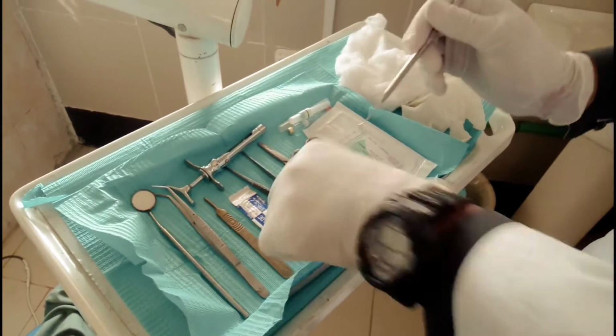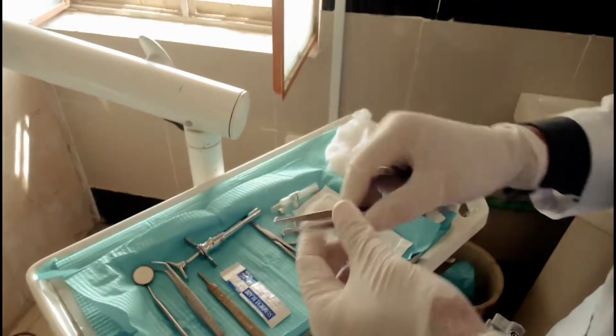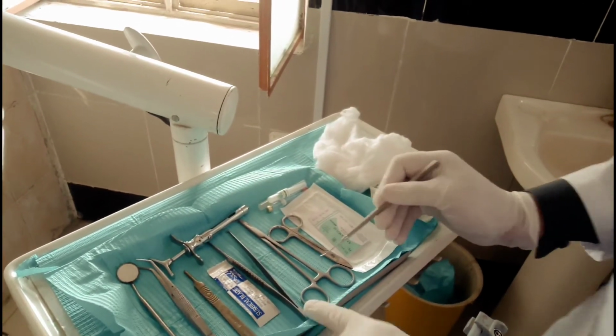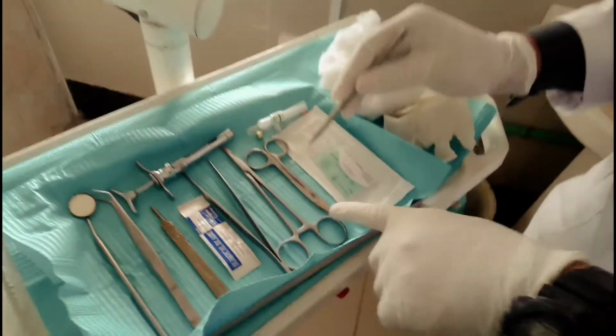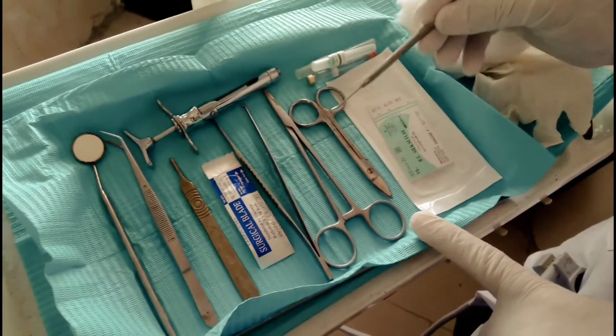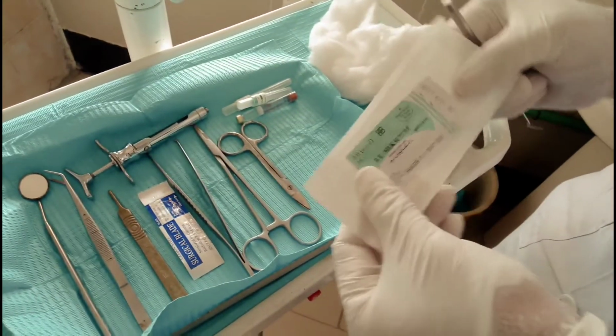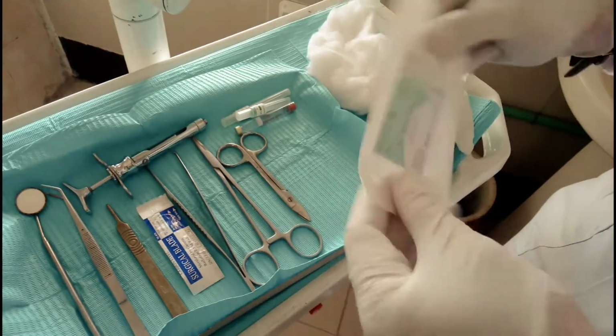And this is the tissue forceps for the retraction of the oral tissues. And this is the needle holder. And this is the scissor through which we will cut the suture. And this is the 3-0 silk suture. We will do the suturing.